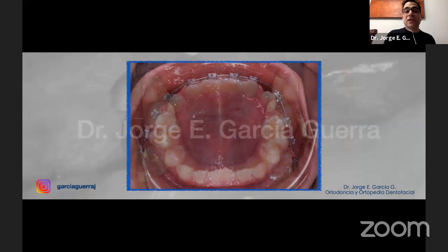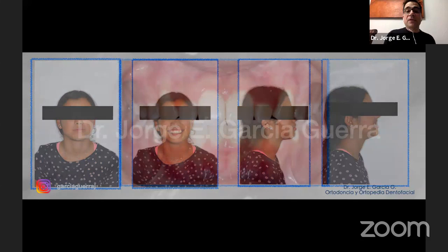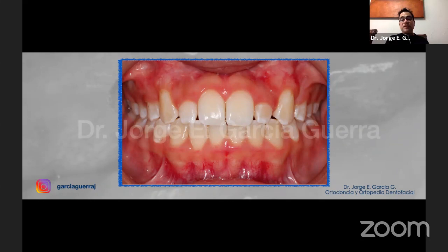You can see there the gingival tissue. And this is July from 2 years ago. This is the day we took the brackets off. You can see the canines are now in the correct position. We have very small lateral incisors. I recommended the patient do gingival recontouring, but I sent her to the perio specialist because of the nature of the case, because she had the root resorption. So I didn't do this myself.